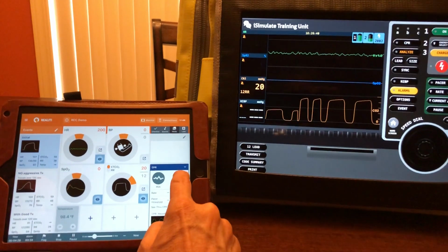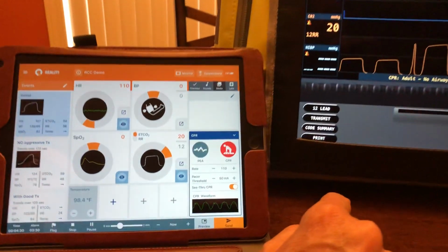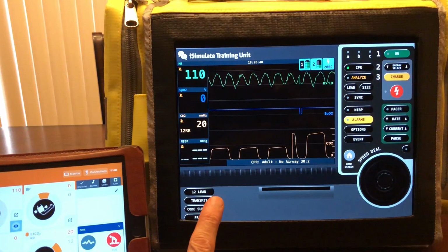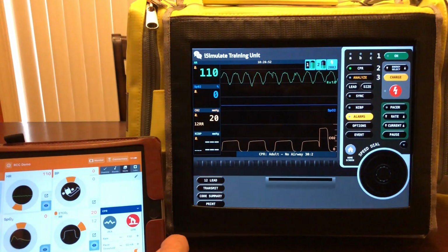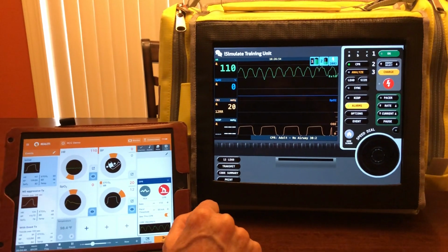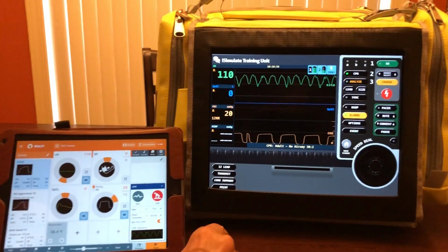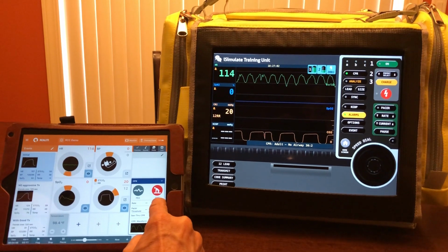Now, once I hit the CPR button, it will turn red, meaning I've started CPR. So on the monitor, you'll see the evidence of CPR being done. You don't see the underlying rhythm because the LifePak 15 doesn't have that. On a Zoll, you would be able to see it with the see-through. But if your compressor is going faster than 110, you can change the rate to match what they're actually doing.